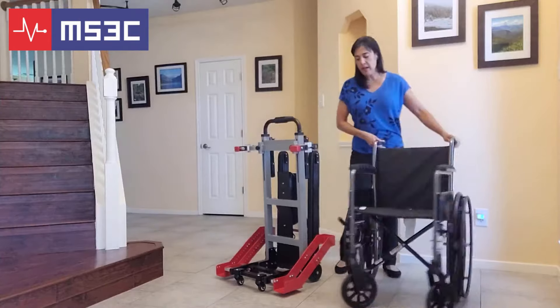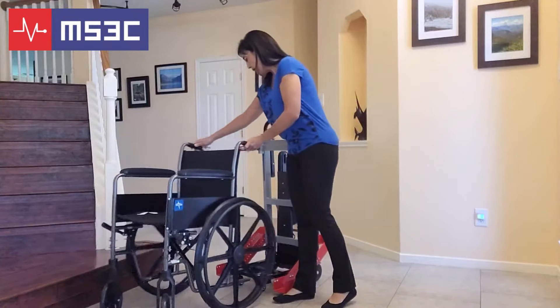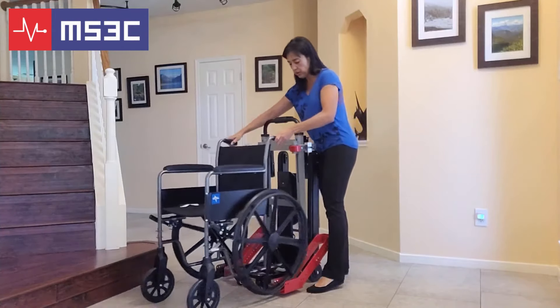You're going to want to take your wheelchair and line it up with the red supports. Once you have the desired width, you can wheel the chair back onto the trolley.